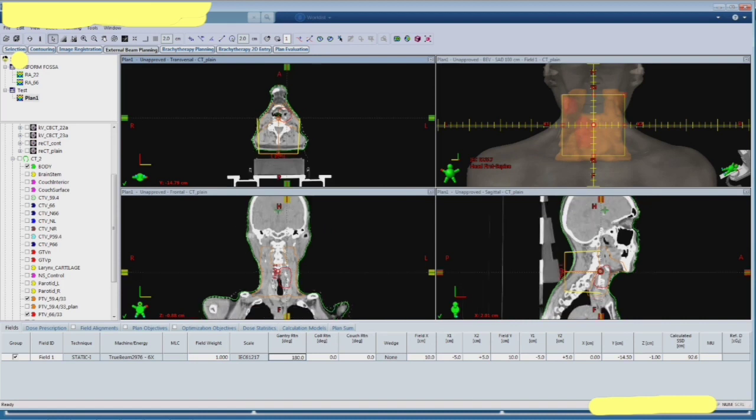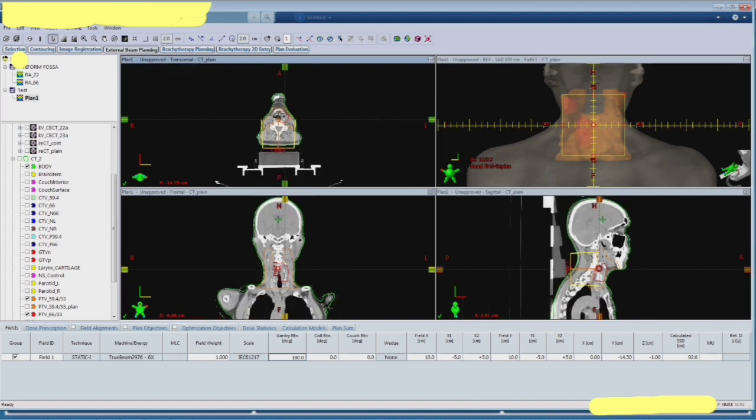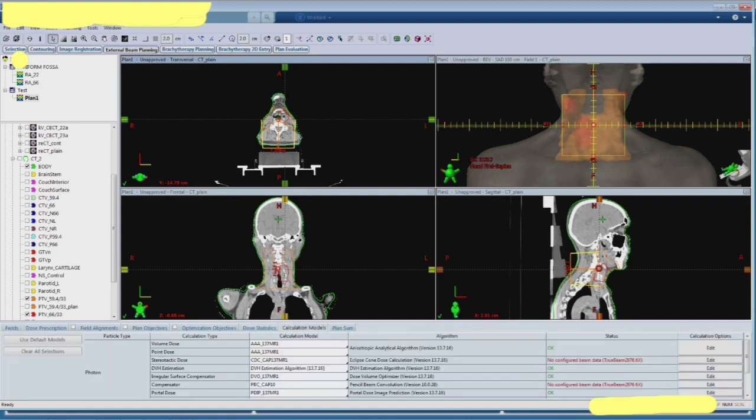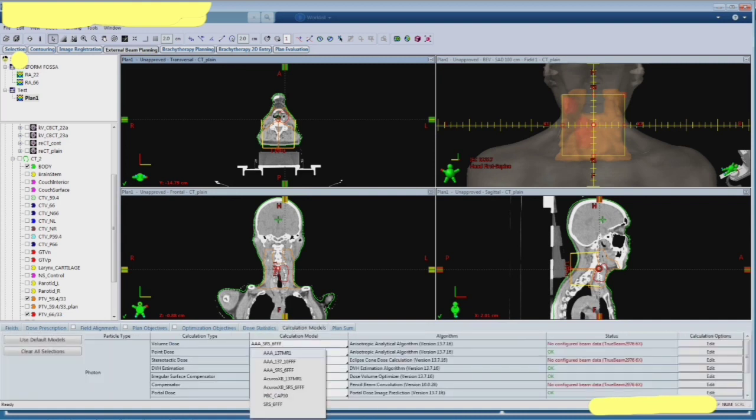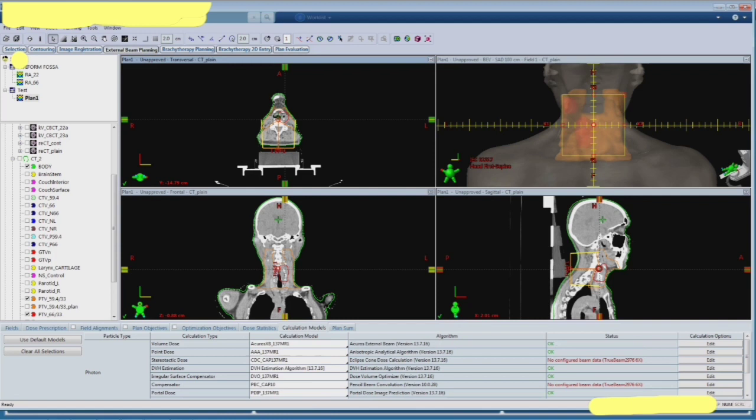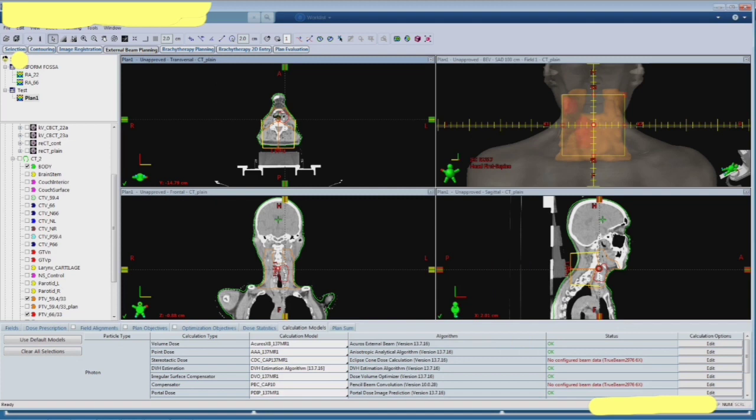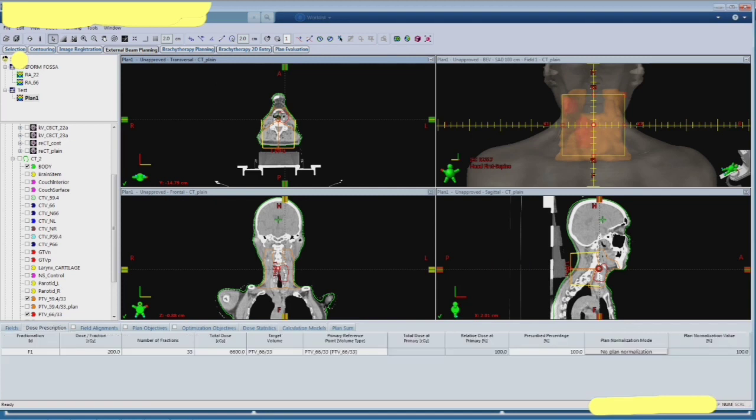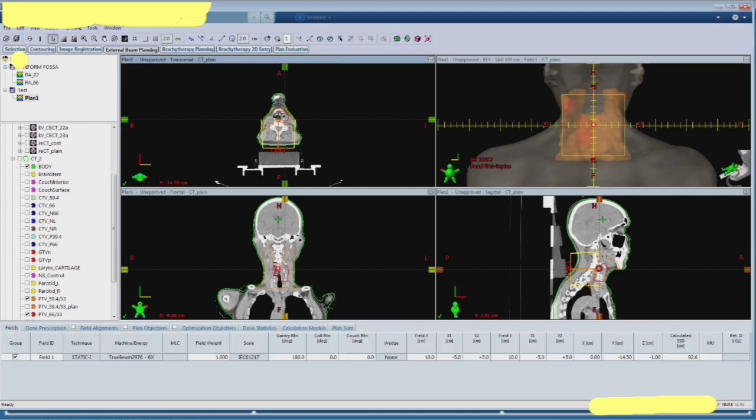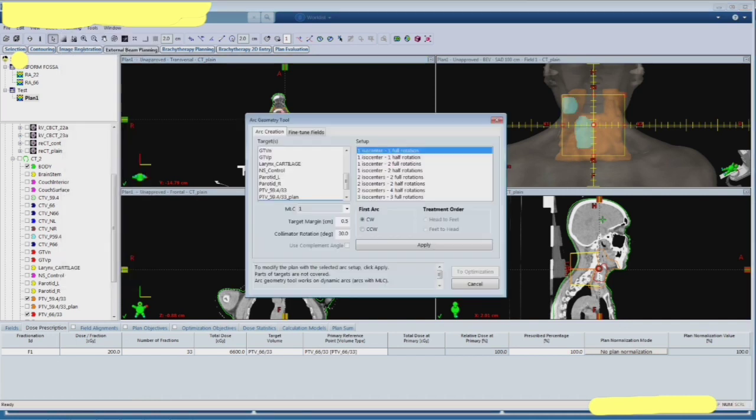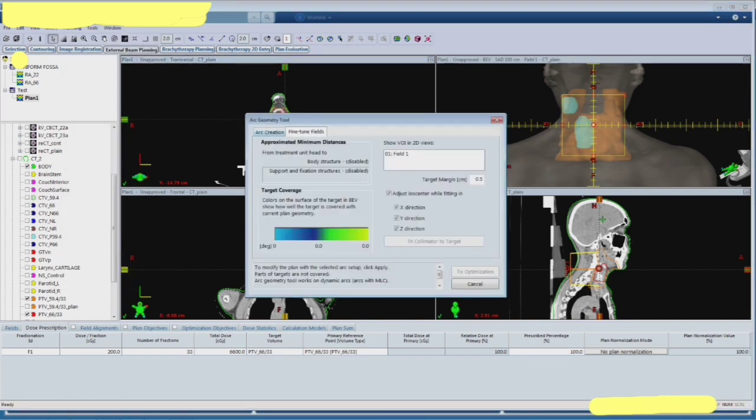And you could see the depth. Then go to the algorithms and choose that. We have Acuros and choose that 2.2 as equal to the thickness of the slice. Check once again the prescription and then go to the geometry tool for Rapid Arc.